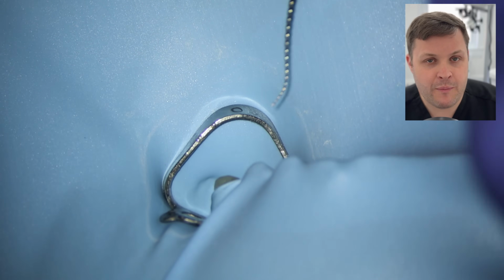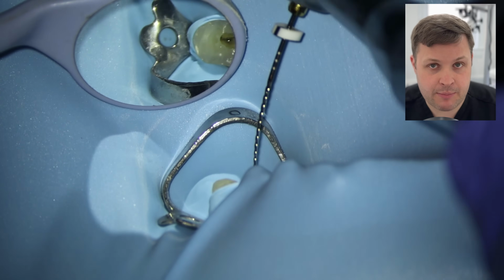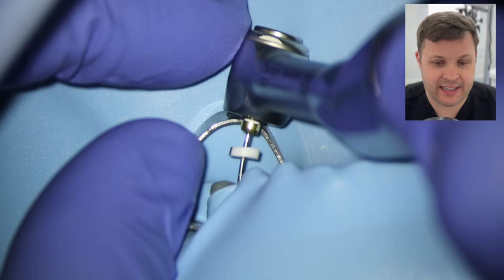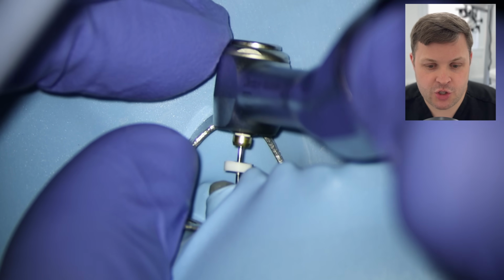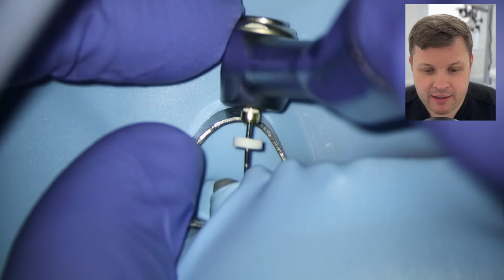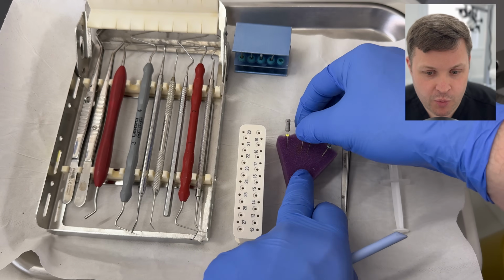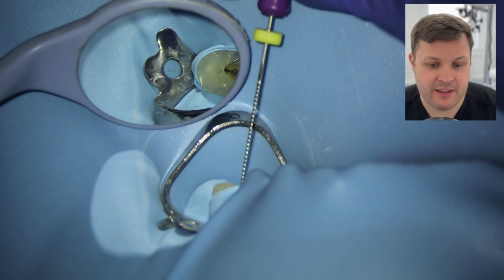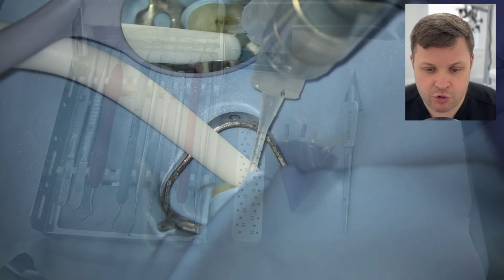And of course, when we introduce this into the canal and then we use it in T mode again, so this T mode is this reciprocation motion back and forth, we can see now that this goes past that kind of ledge, and then once I've passed the ledge, you press the button again and it turns into a rotary action, and I'm just sort of automatically shaping out that kind of ledge or catch. And then always recapitulate. That's really important. And you'll notice now that this hand file is actually moving up and down really nice and easy. It's not so much getting caught on this ledge.